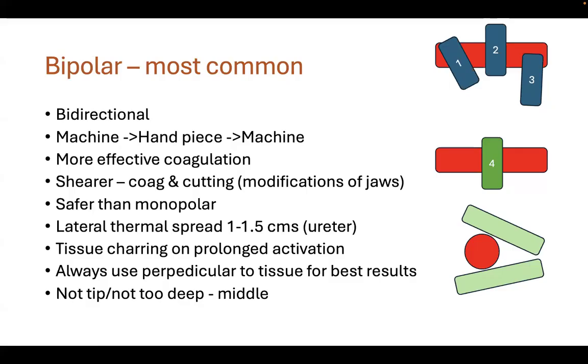It's a diffuse plexus bleeding which is happening. They run the monopolar over it for a long period of time in order to cause the superficial coagulation. So in comparison to the monopolar, bipolar is actually a bidirectional current. The very simple fact is that there is no patient plate required while you are using the bipolar. Patient plate is only required for monopolar.